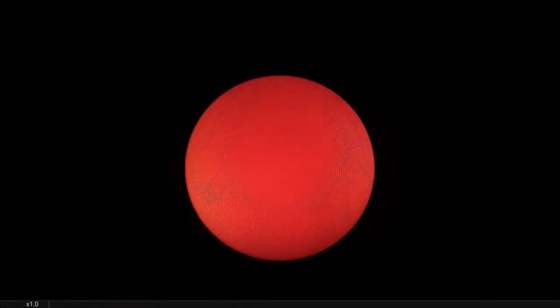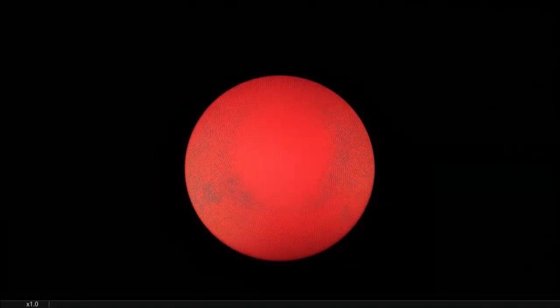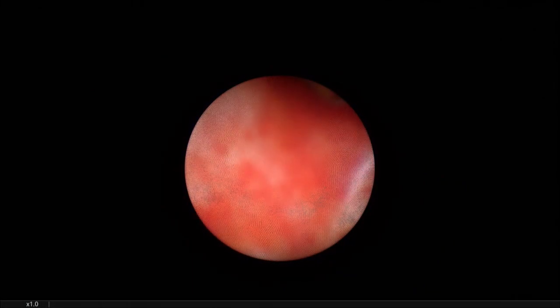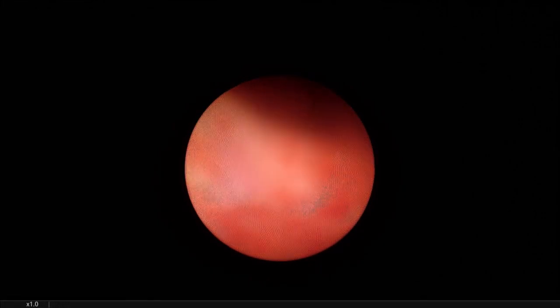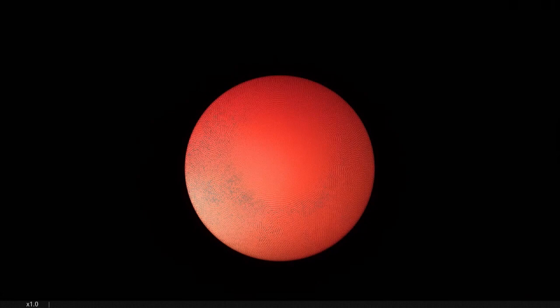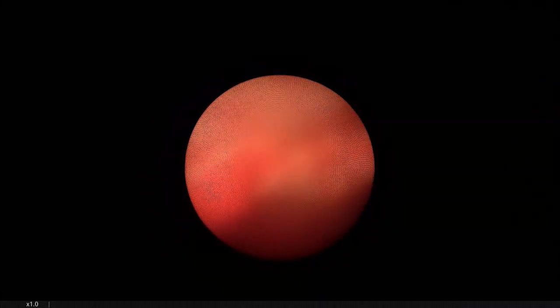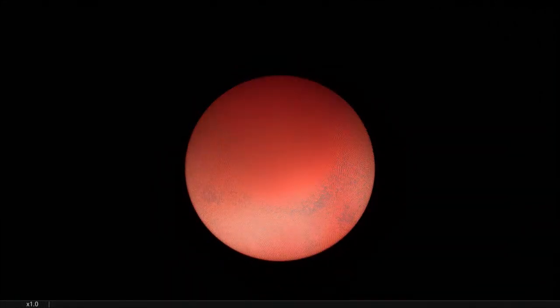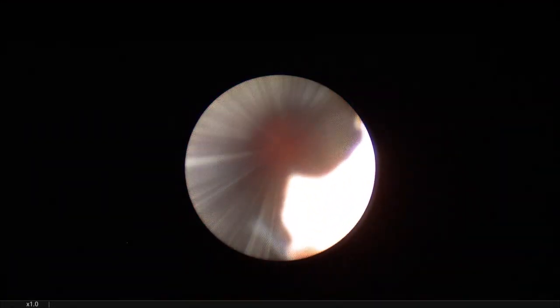I'm very sorry for this bad view, but you should know that this camera is a laparoscopic camera, not a urological camera. Laparoscopic camera means rigid camera with a good resolution, but if there is a certain hematuria, the imaging is very, very bad. Therefore, we always use a flexible camera in endourology. Yes, we see clearly that it's a good vision. We see the stones and we see the fragmentation. And I think this is normal for PCNL. Next.